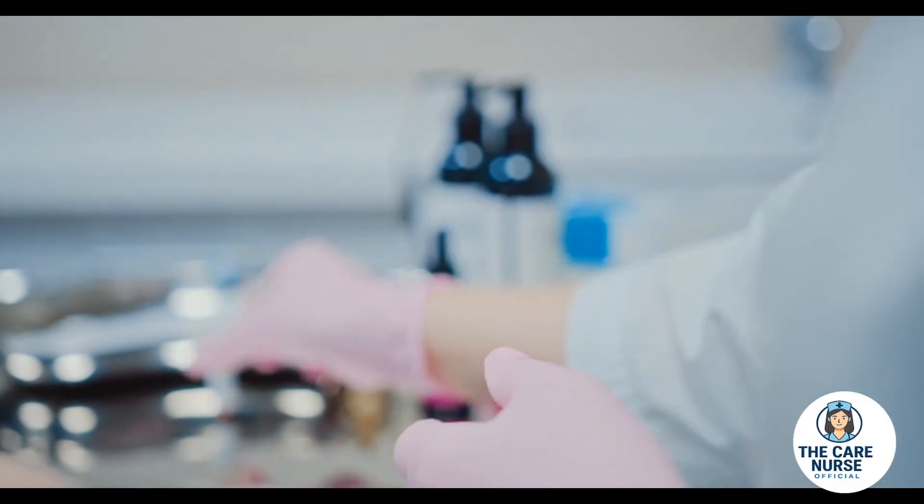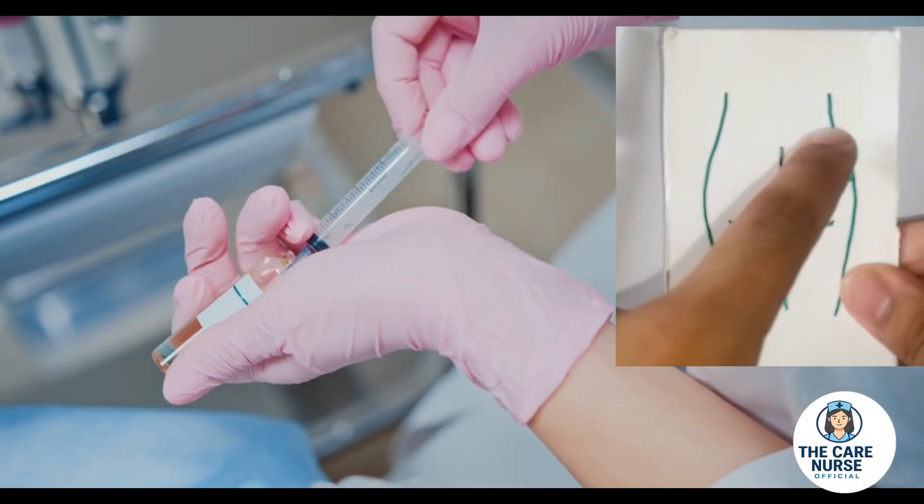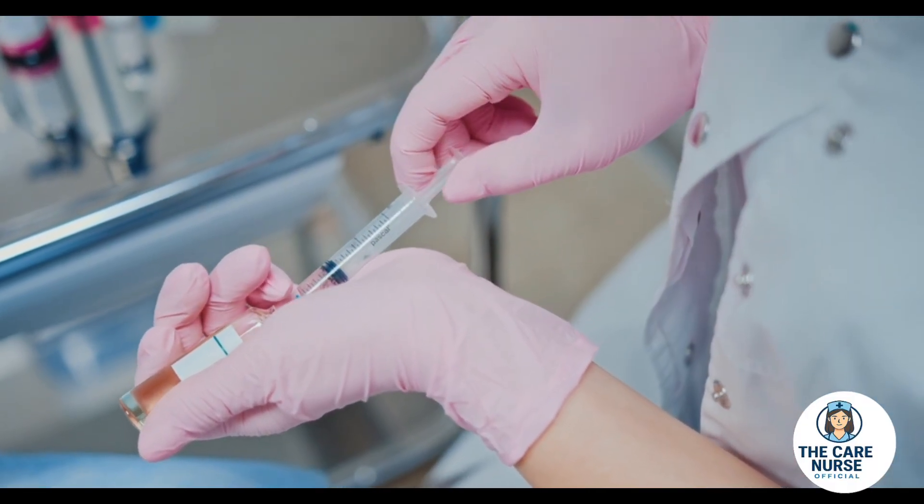For this demonstration, the selected site is the upper outer quadrant of the buttock, which is one of the common safe zones for intramuscular administration.